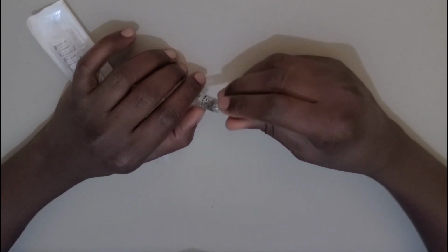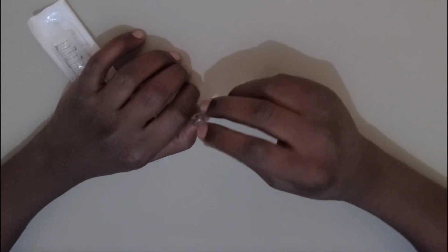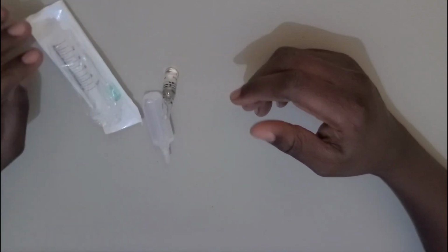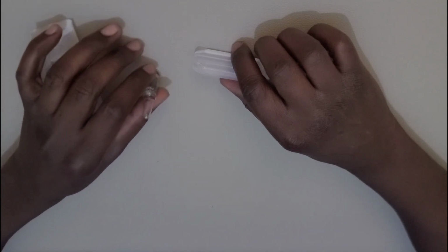Today I'm going to show you how we can dilute gentamicin IV for neonates. Genta is given to children with infections and fevers, and is also given as prophylaxis in combination with ampicillin. So Genta is not given concentrated like this, so we need to dilute.